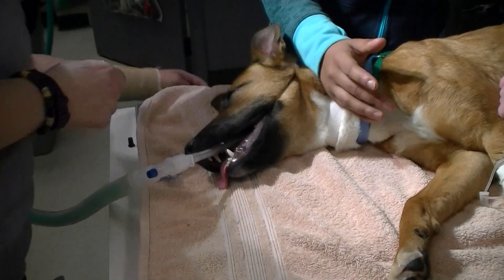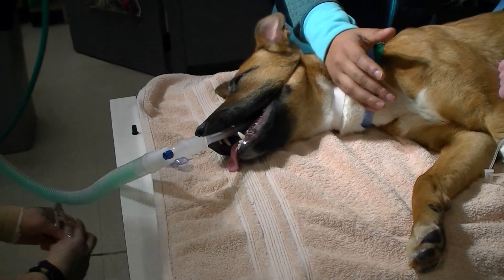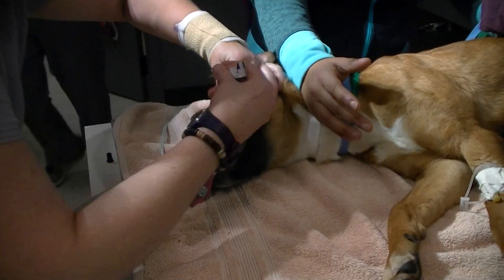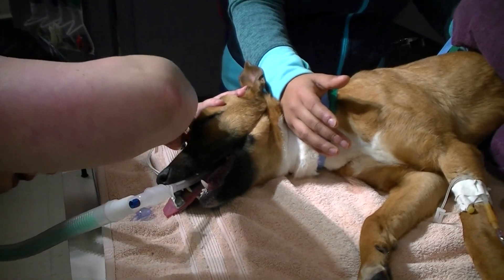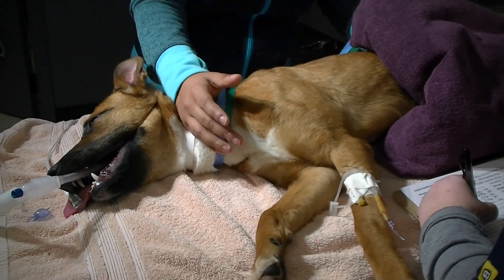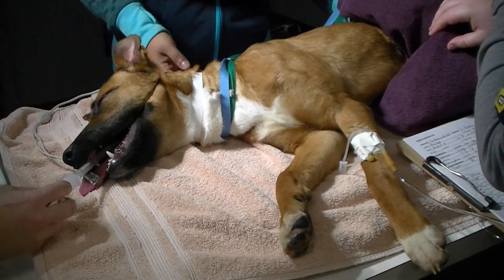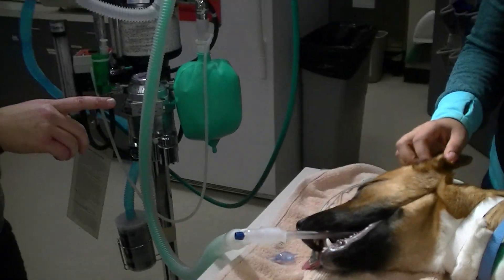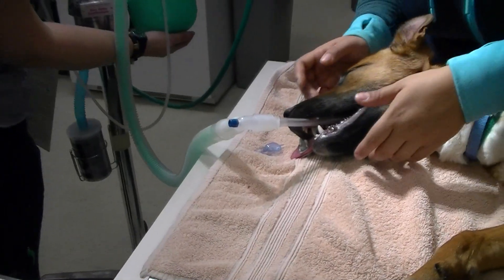She's breathing. I'm going to put on pulse ox, monitor heart rate, and lubricate her eyes. The cuff is inflated, eyes are lubricated, and I've got my pulse ox on. I need to make sure that the tube isn't leaking, so I'm going to give her a couple of breaths and have my assistant smell for isoflurane to check for a leak.